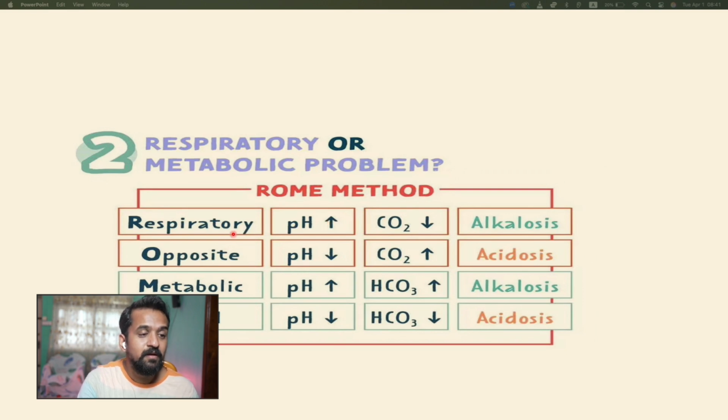How would you know that this patient has a respiratory alkalosis? The pH will be high. That means there is alkalemia. If pH is high, that is alkalemia. If pH is low, it's acidosis. Now what kind of acidosis is determined by looking at the pH and the CO2 in terms of respiratory, and looking at the pH and bicarbonate if it's a metabolic case.